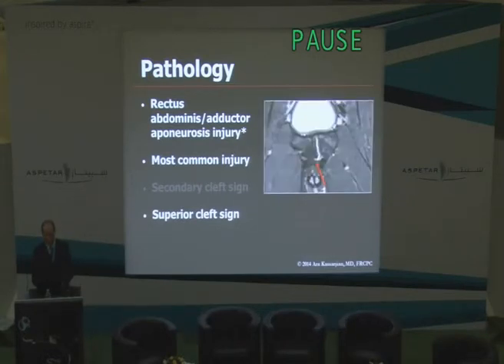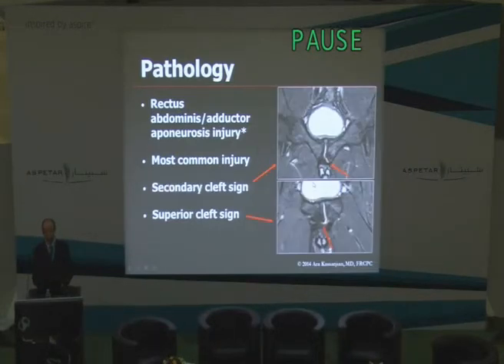And here's another case where they can be subtle, but if you look closely and you have high-resolution images, you can see how there's a small superior cleft going towards the right side of the patient in this case. And to compare the two, I think if you start looking at these, you can start differentiating that one is actually oblique and inferior, and maybe posterior inferior, and the other one is more horizontal and usually more anterior.